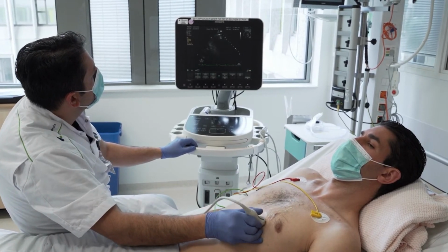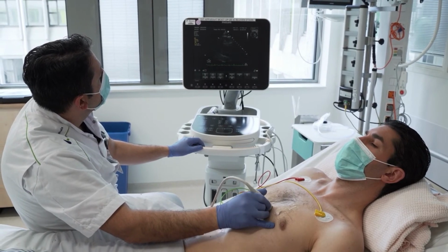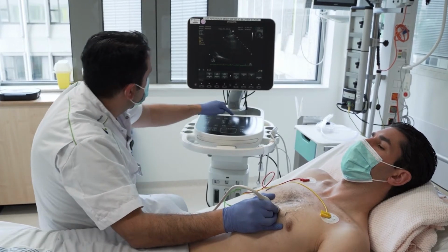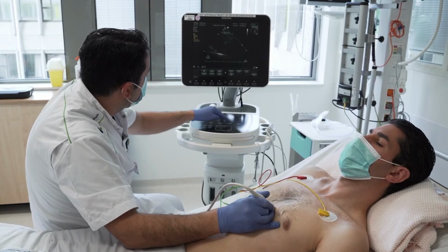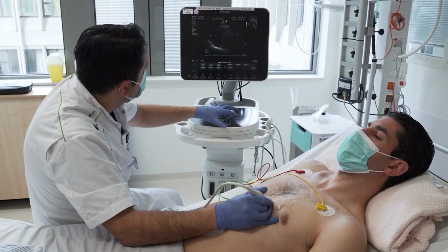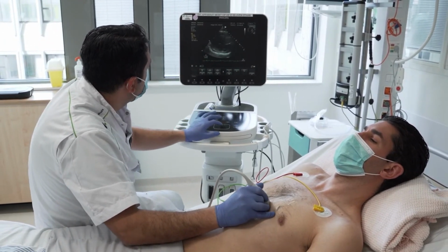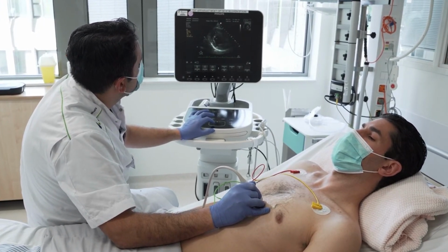In patients with pulmonary emphysema or asthma, it's quite often difficult to get good parasternal or apical views, and sometimes you can only get the subcostal view. And if you're very unlucky, the patient also has air in the stomach or colon transversum, and you get no cardiac views at all. So then you're a bit blind.